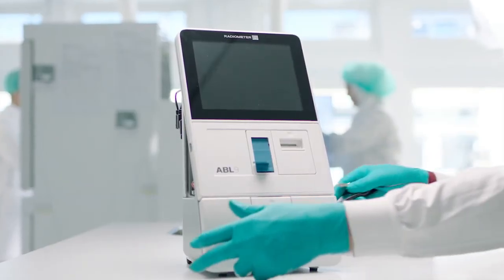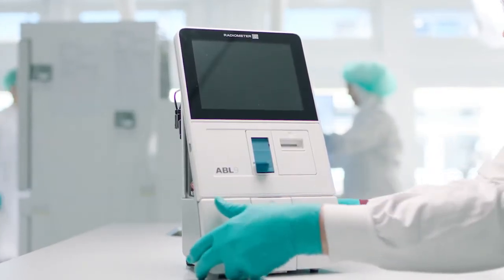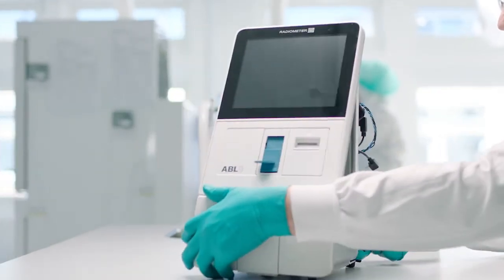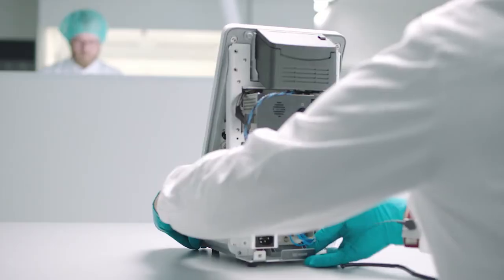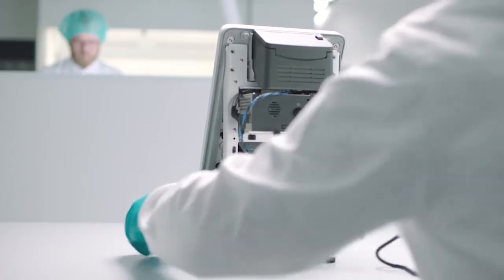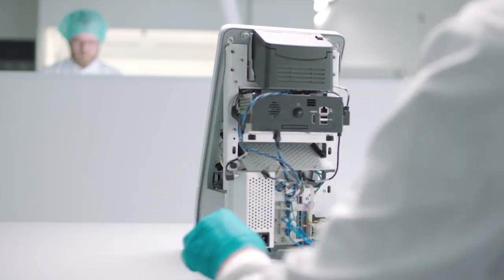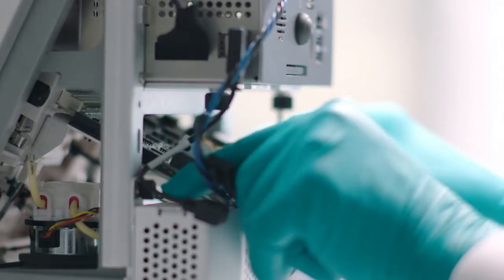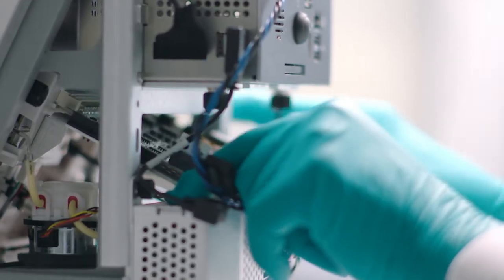That's what Radiometer's renowned engineers in the US and Europe did. Using proven thick film sensor technology, they reimagined the blood gas analyzer.